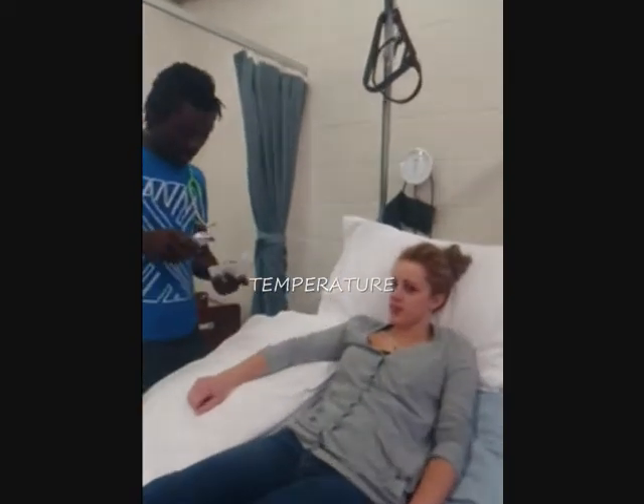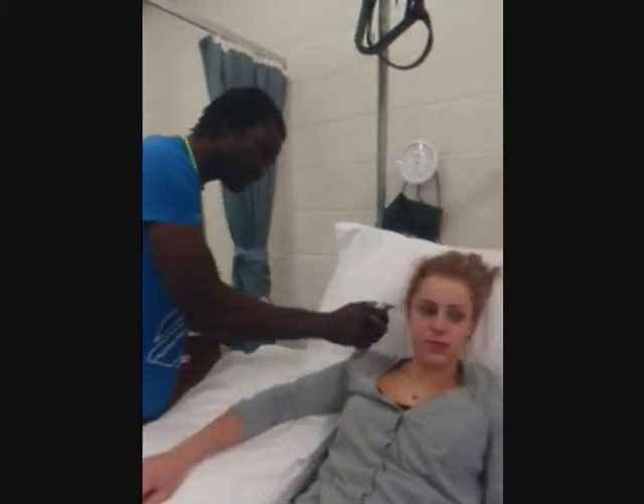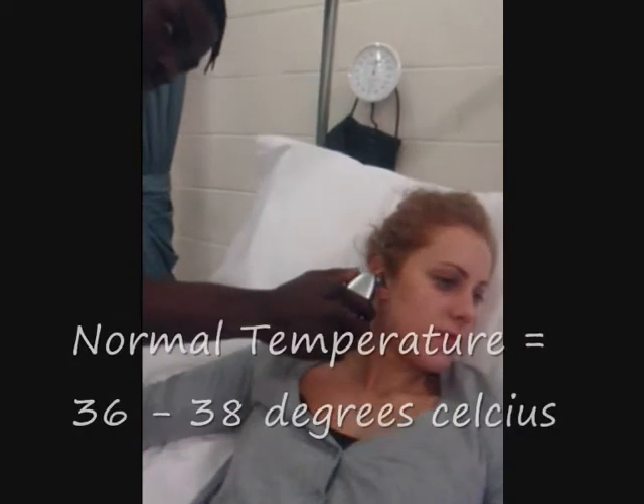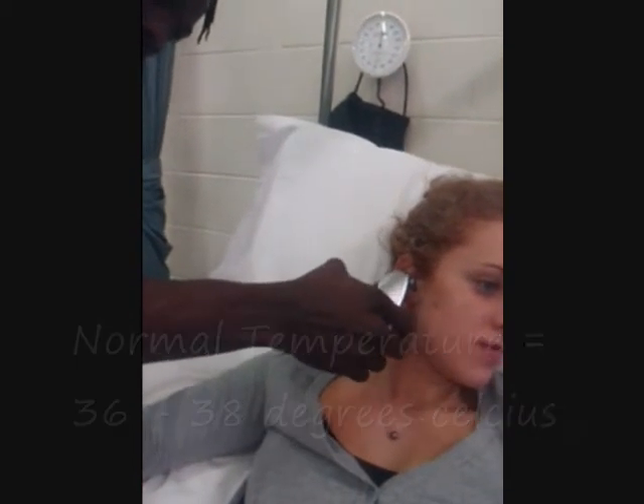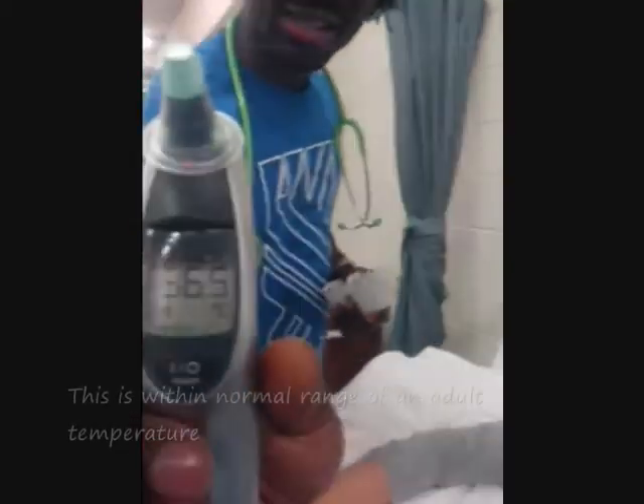Body temperature alterations can indicate patients at risk for infection or hypothermia. The acceptable core temperature ranges from 36 to 38 degrees Celsius. Today we are using a tympanic thermometer to record the patient's core temperature.